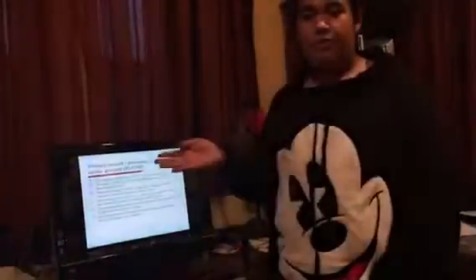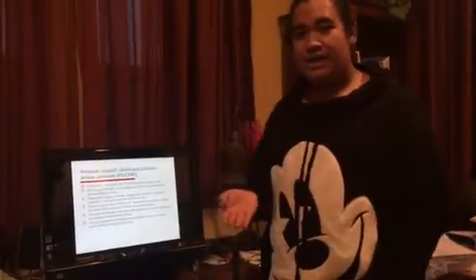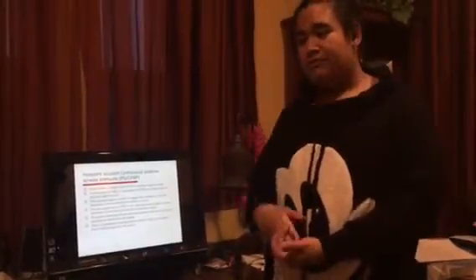So it says in here that this pressure support CPAP could be delivered both together, or it could be delivered separately. You have a choice of having pressure support CPAP, or just pressure support, or just CPAP only. Now, if you want the patient to be put on just CPAP only, which is one of the weaning processes that we do, we put the pressure support to 0, and then we just leave the CPAP as it is.